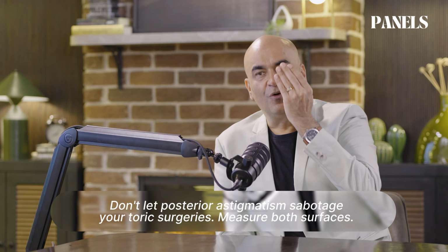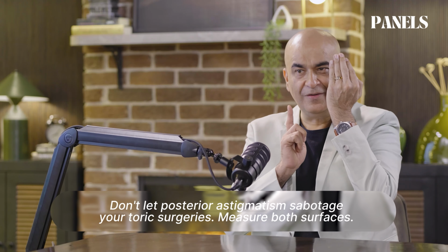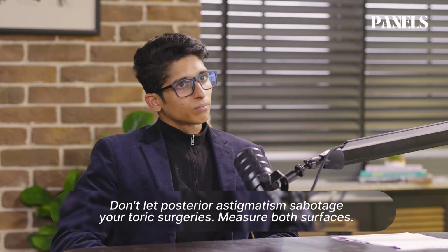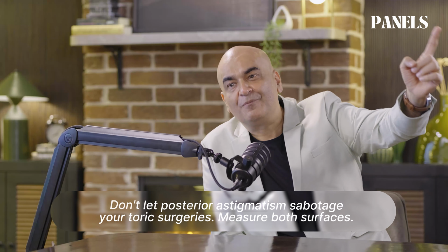So you want to correct with the rule astigmatism for 1.5, you put 2.25. But there is a posterior astigmatism against the rule, which is already cancelling the 1.5. So the net result left is 0.75. But what have you corrected? 1.5. The patient will have reverse astigmatism of 0.75. Bad result. And then the young surgeon is wondering what happened. I will not do toric surgeries. Something has gone wrong. What has gone wrong is your understanding. So taking into account the posterior corneal astigmatism intraoperatively also is very important.